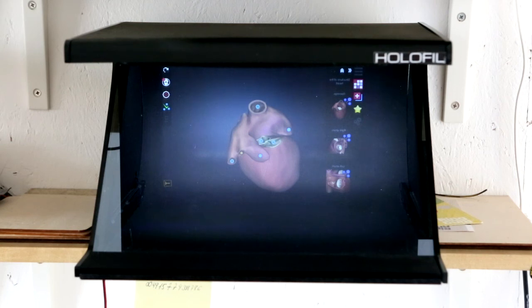Of course, you need software in between to convert the output of your CT scan data to something that is presentable here. It's the same thing if somebody is going to 3D print from MRI scans; they also have to convert it using some software. I actually saw in some of your workshops some presenters using CT scan images to output into 3D printable formats. So it's similar. Instead of 3D printing it, you 3D visualize it. Rather than printing, you visualize. The input data is coming from the same medical field.